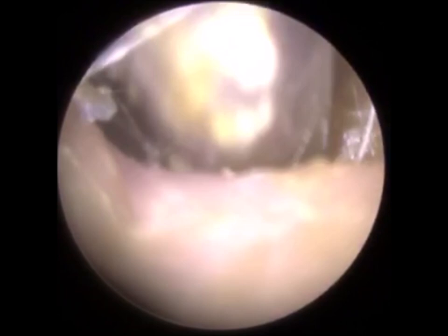So I'm just using the forceps again, just trying to extract this plug, but the problem with forceps, as I said, is that sometimes it just shreds this keratin, but in this instance, I've managed to hopefully get this plug out. Yeah, it's a big piece there. Just going back in to get the tail end of that plug and see if there's a bit more.